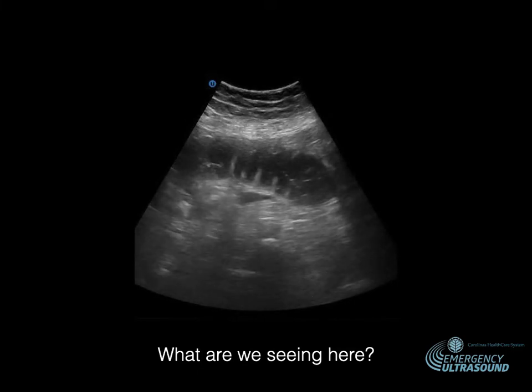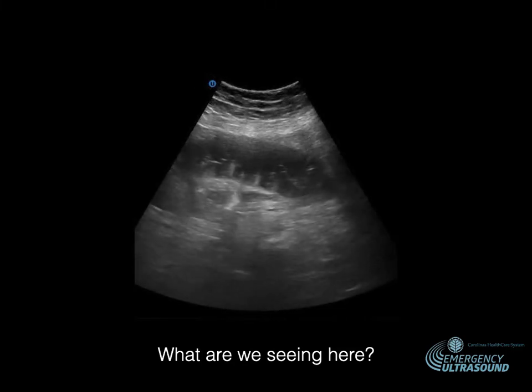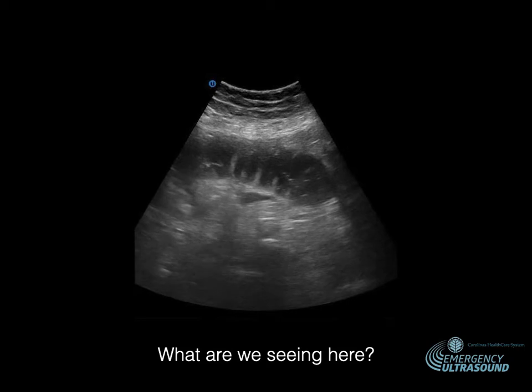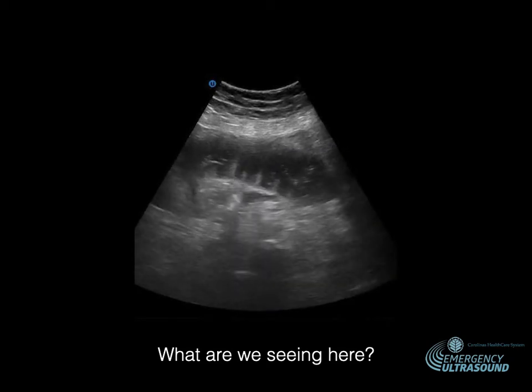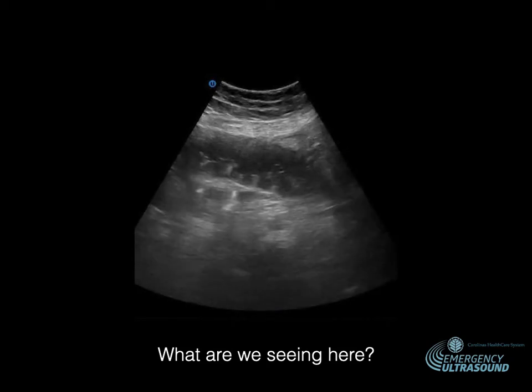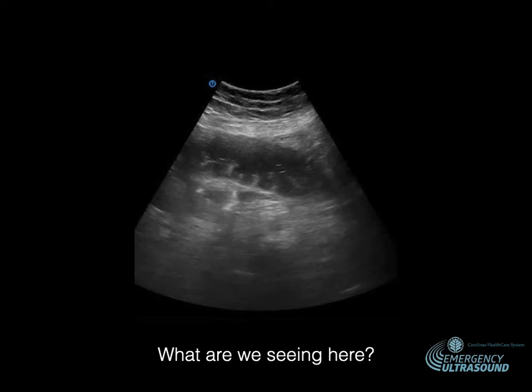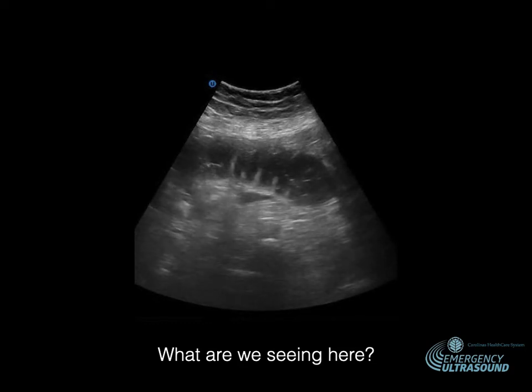We're seeing not a whole lot of peristalsis. Actually, there's really no peristalsis that I'm seeing here. You can say that maybe you see some to and fro movement of the contents, but that just really isn't doing a whole lot. But we're definitely seeing those plicae circularis projecting into the center of the lumen, making me more concerned for bowel obstruction.